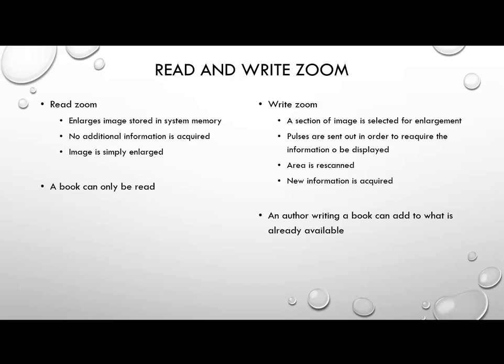If you're the author of a book and you're writing a book, you can add to whatever information you want. So you can add to a book if you're the author. So that's write zoom. So read zoom, the book is written, we just make it bigger. Write zoom, we can add what we want into the book and make it bigger.